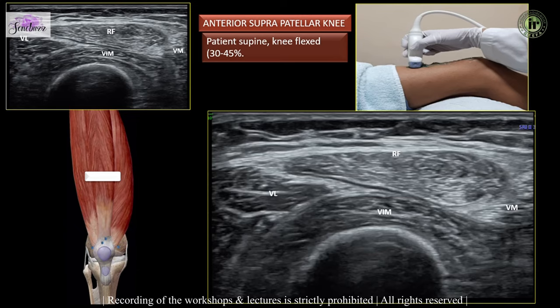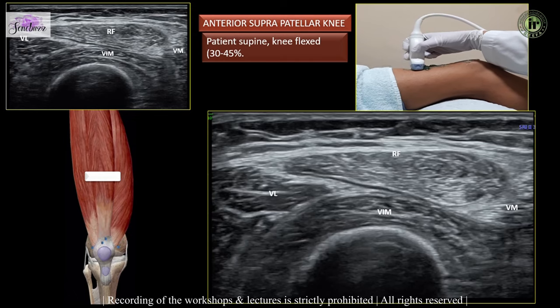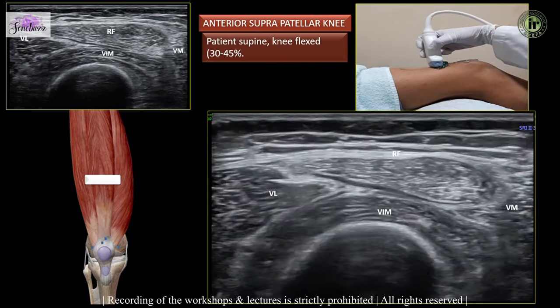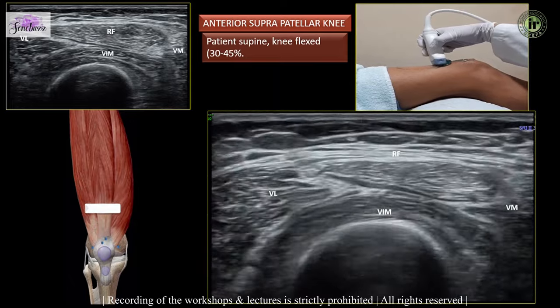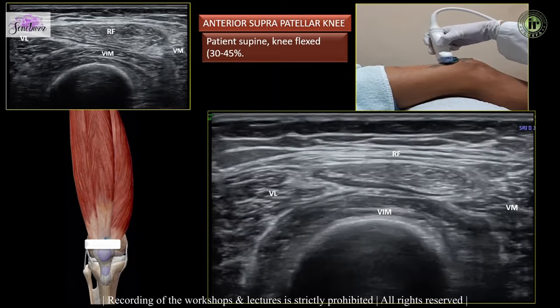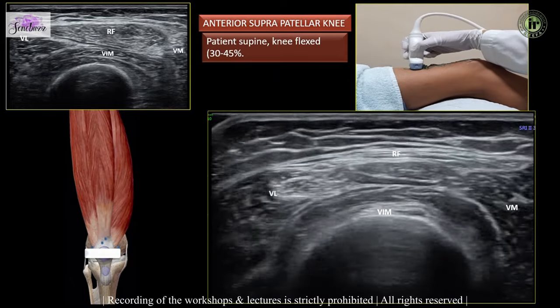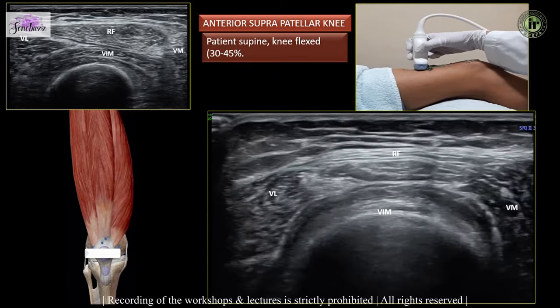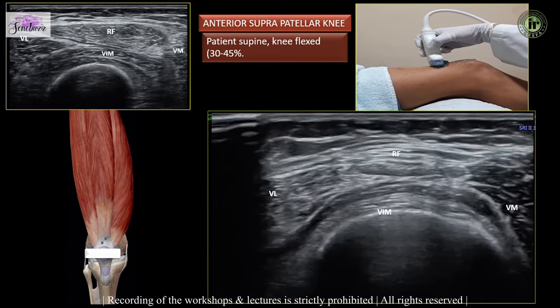The rectus femoris is the most superficial structure, and the vastus lateralis and medialis form the intermediate layer, while the deepest layer is formed by the vastus intermedius. As we move down, we can see the muscle fibers getting thinner, apposed, and ultimately fusing to form the quadriceps tendon about one centimeter above the patella.